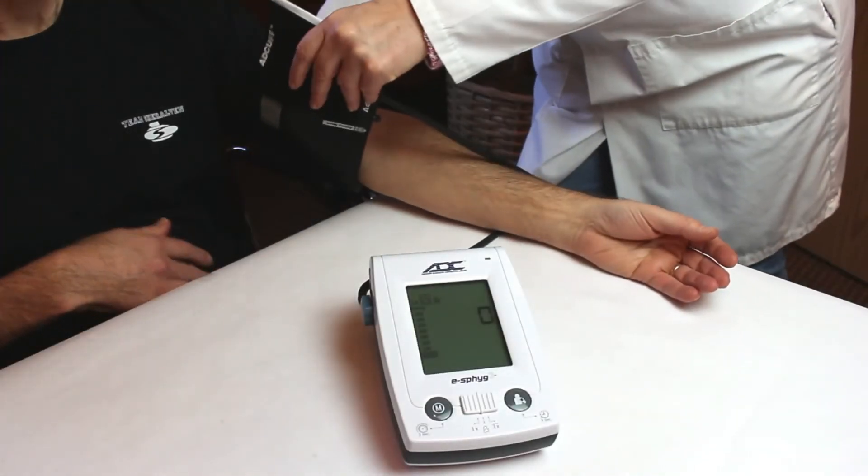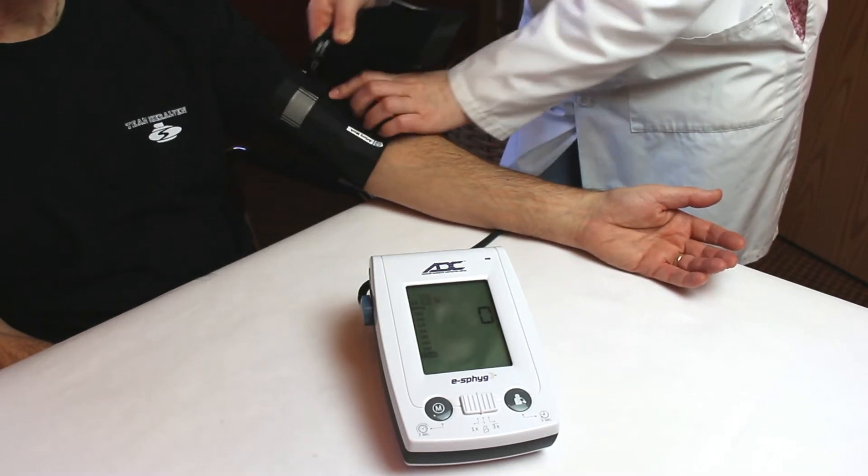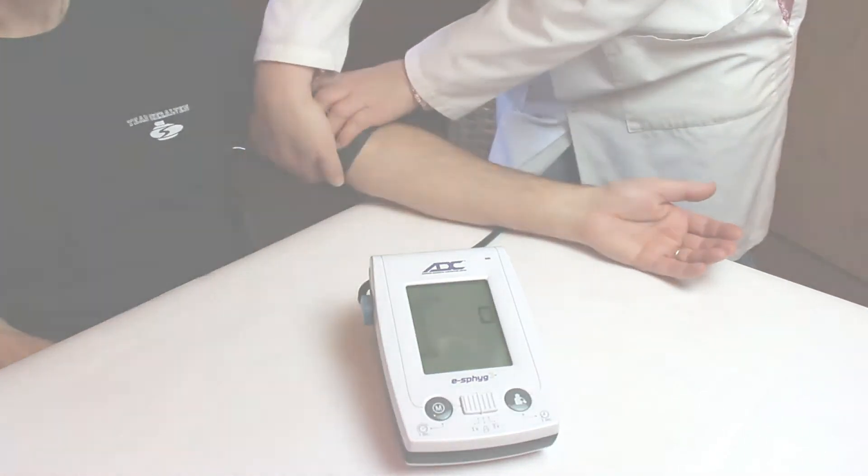Place the cuff around the patient's arm. The cuff index line should fall within the printed range markers. If not, select a larger or smaller cuff to ensure an accurate reading.